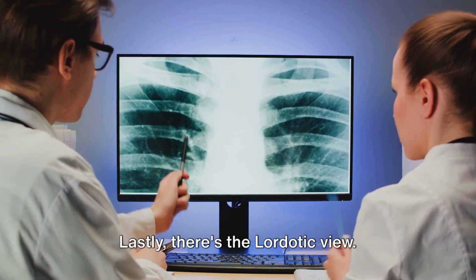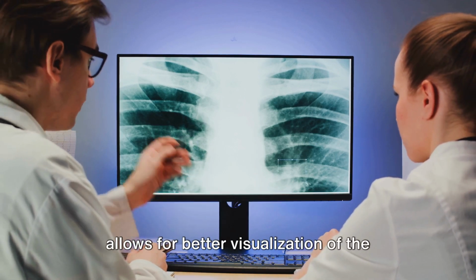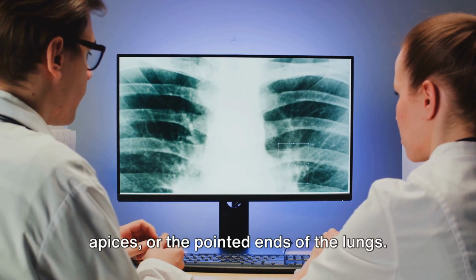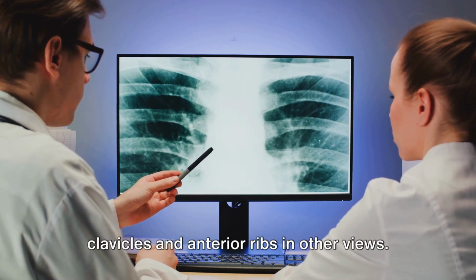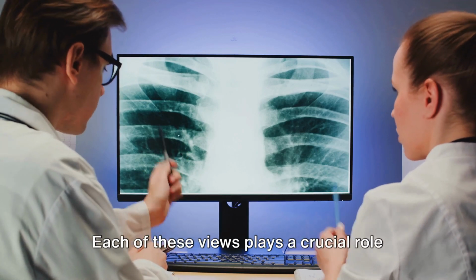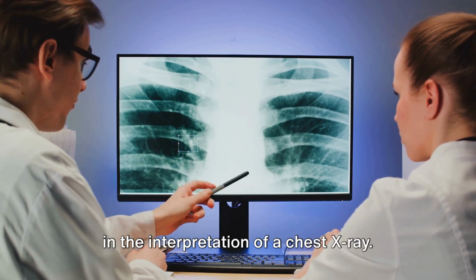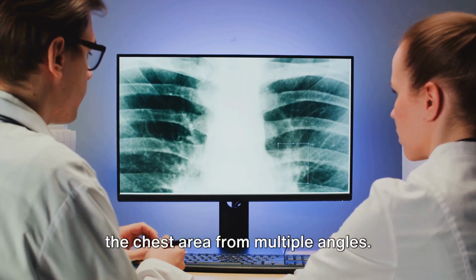Lastly, there's the lordotic view. This involves an angled beam, which allows for better visualization of the apices, or the pointed ends of the lungs. These are normally obscured by the clavicles and anterior ribs in other views. Each of these views plays a crucial role in the interpretation of a chest X-ray. They provide a comprehensive picture of the chest area from multiple angles.